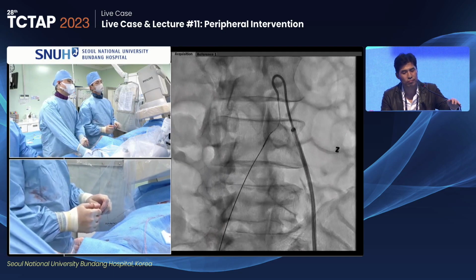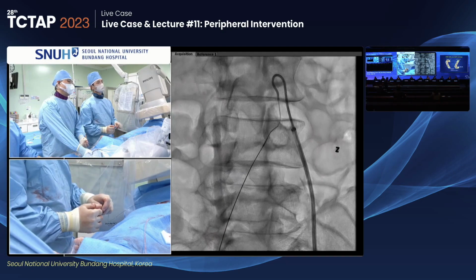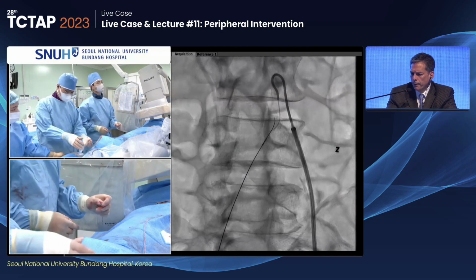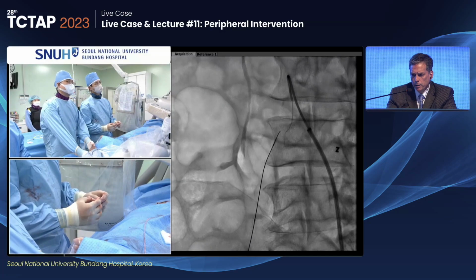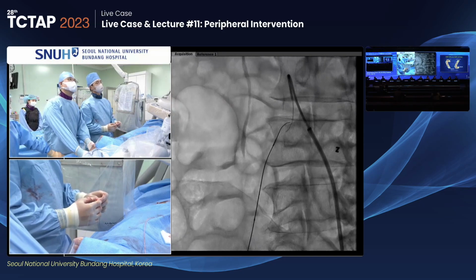Okay, just 3 minutes. Give me 3 minutes, and then I will change to the reverse CART. Does anybody feel that the right antegrade guide catheter would be better with an IMA or something like that to give you a little bit more support from the hook? Maybe in this case, an IMA catheter seems to be better.